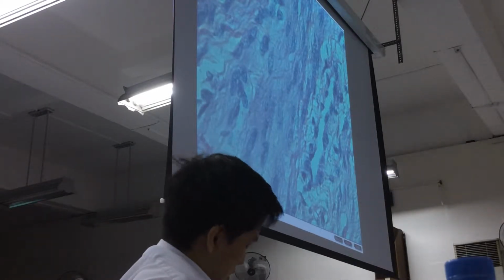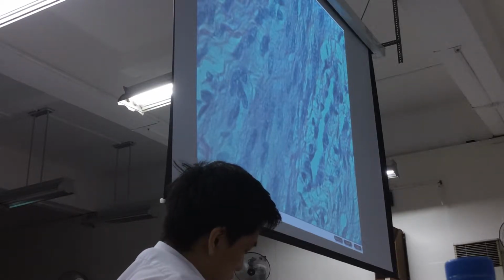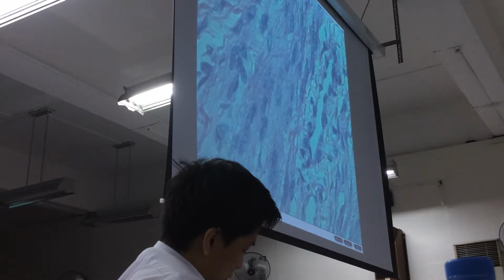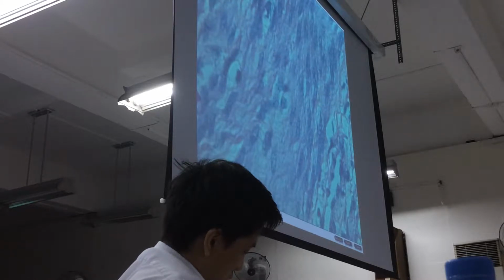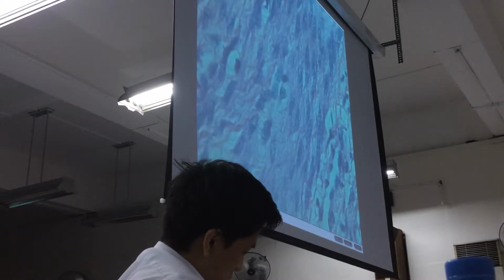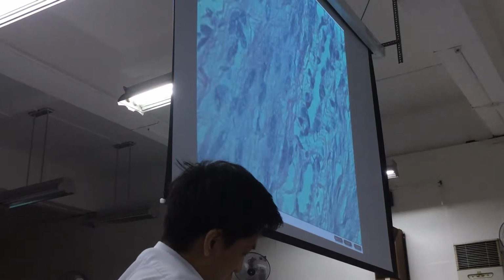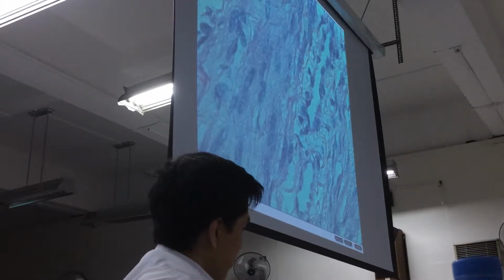The leiomyocytes are fusiform or spindle-shaped with elongated, centrally located nuclei. They are disposed into bundles, or fascicles, that intersect at 90-degree angles. The stroma, or the connective tissue pasting all the cells together, is fibrovascular in nature.